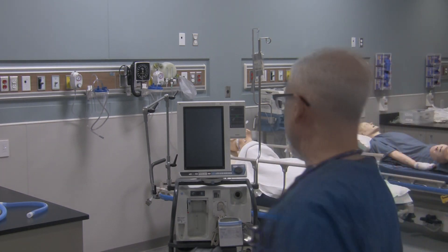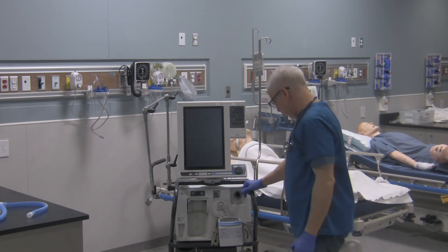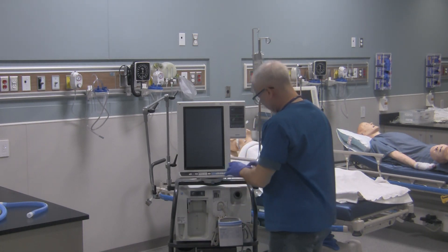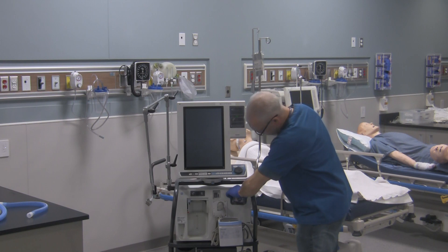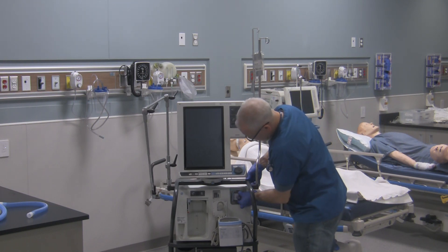On the ventilator, it goes onto the ventilator right over here. So make sure the ventilator's wheels are locked, and attach that filter to the ventilator. Make sure it's in there nice and snug.